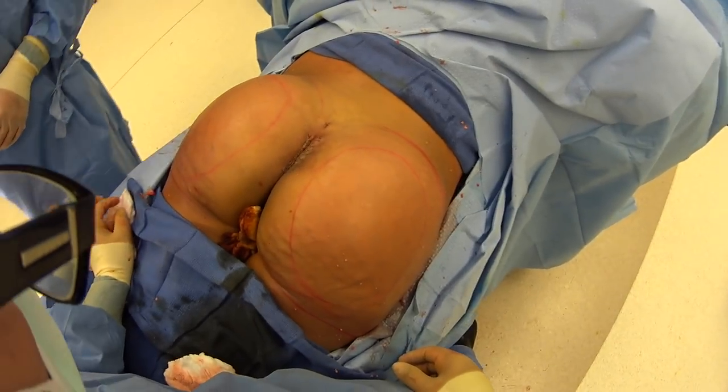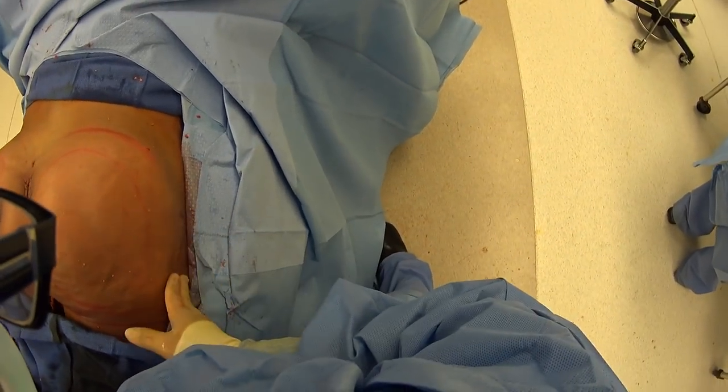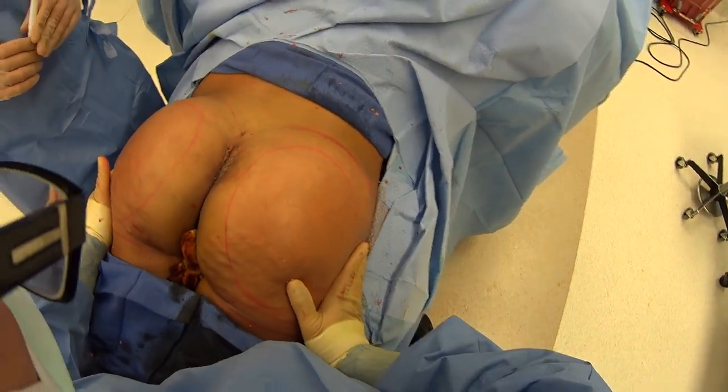Now we've finished our butt augmentation. You can see her implants are in here, we've done the fat transfer. You can see how we've really filled out our hips and the upper portion here. You can see how when this liposuction all settles, that's really going to give her a phenomenal shape.